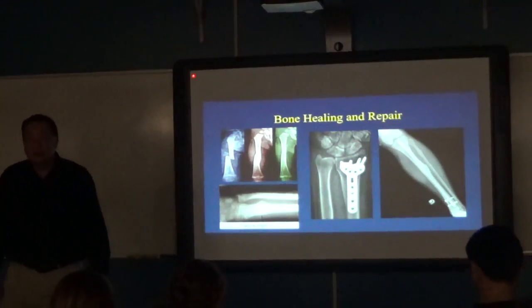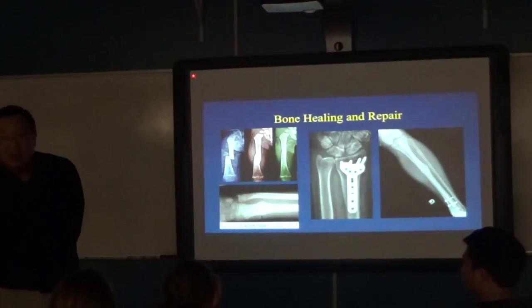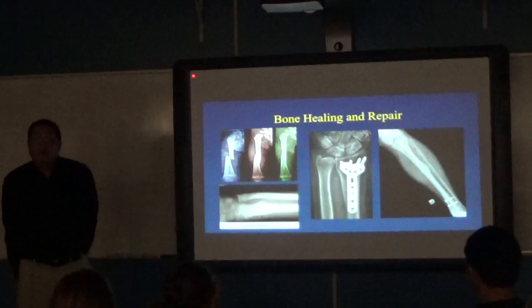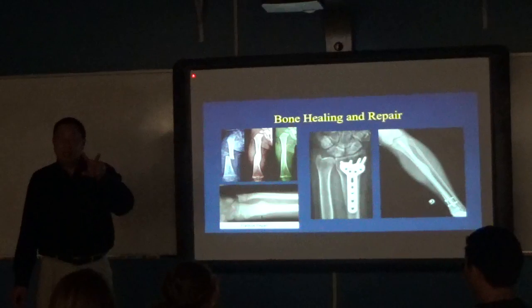Yes. How would you re-break the bone? I'm sorry? How would you re-break the bone? With a saw. We've got an oscillating saw. Unfortunately, when you re-break the bone, it's not only a two-plane cut, it has to be a three-plane cut.